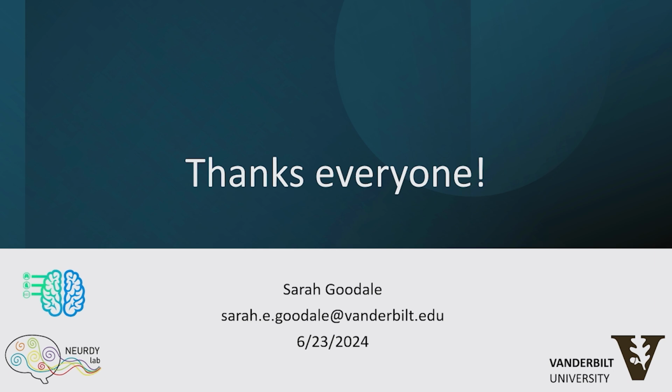Again, the best thing we do is if we see really bad loss of signal or whatever it is, we typically just restart the scan over. That's why it's very important to be watching your physiological data as you are collecting, because if you are very interested in that signal, it needs to be acquired correctly and accurately. So we typically have a grad student or somebody actually watching the computer for loss of signal.